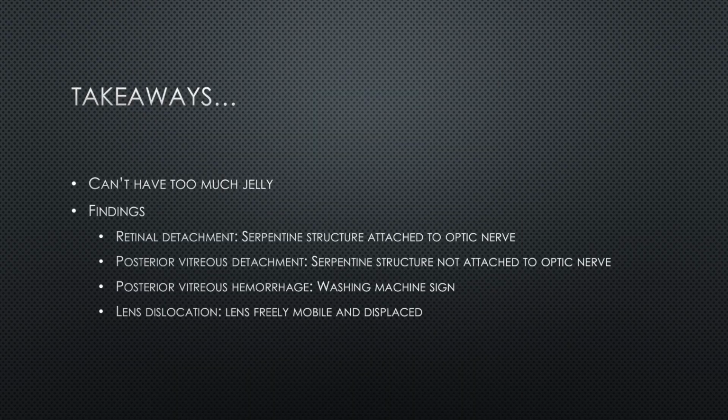So big takeaways today. You can't have too much jelly. Put a lot of jelly on that patient's eye. It'll make them feel more comfortable. It'll give you a better image as well.